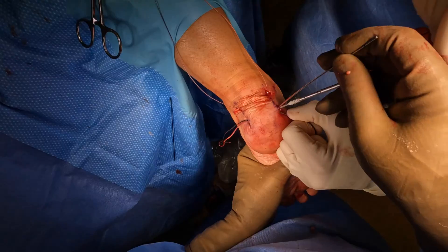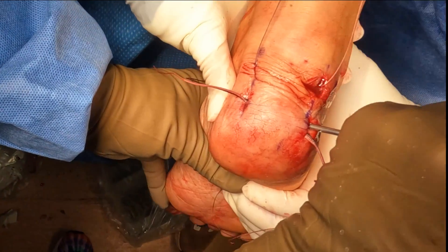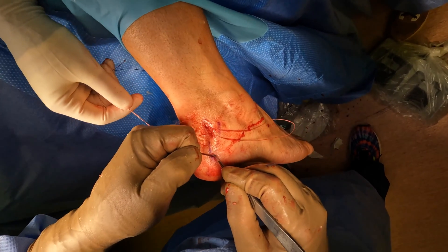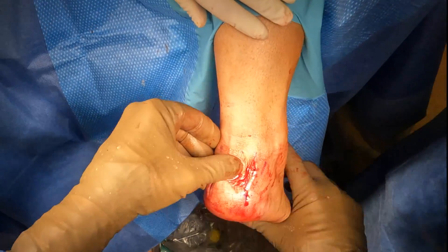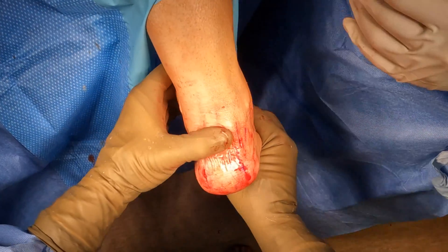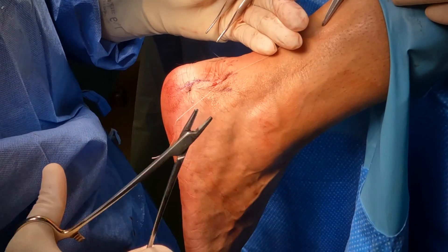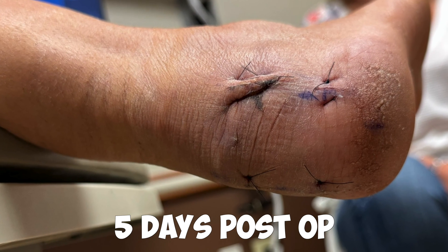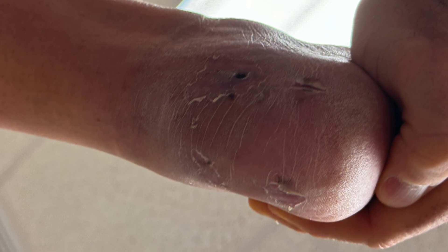We're tensioning these as tight as we can to resistance — not making them too tight so that it gives us unnecessary tension when it pulls out. So there you have it. We reattached that small amount of the Achilles tendon that was slightly disrupted during our process of removing that posterior prominence or Haglund's deformity. We used four small incisions to close this up, and there you can see this postoperatively — four tiny incisions. This is so much less pain than the open procedure. If you have any questions, drop them in the comments section below.